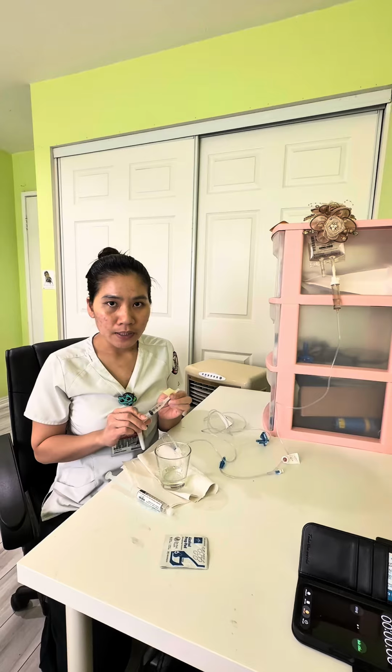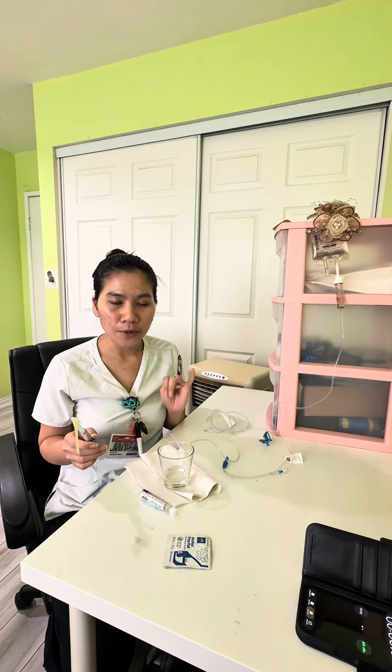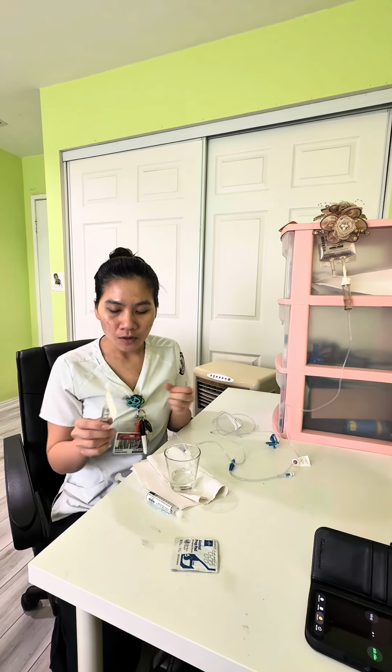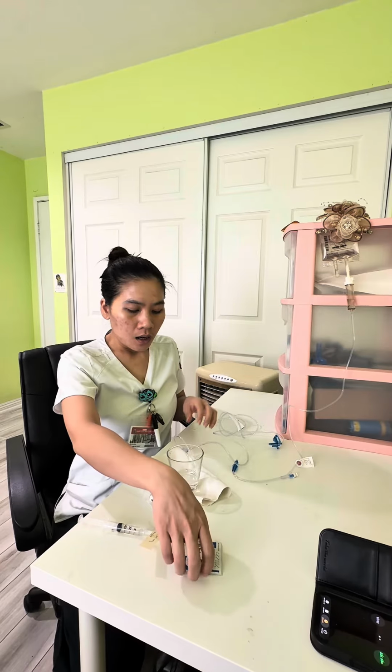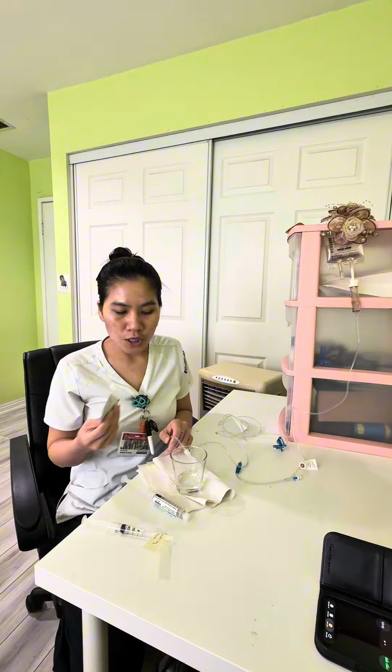Before I give the patient medication, I have to verify the doctor's order. I use the five rights for medication administration: right patient, right route, right time, right dose, and right medication. I have to verify the patient's name and date of birth, also on the wristband. I also check the patient's allergy before I perform the medication.